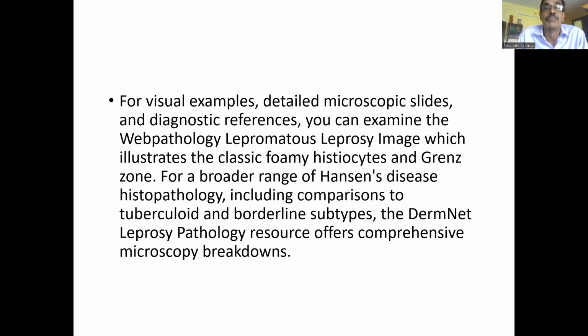For visual examples, detailed microscopic slides, and diagnostic references, you can examine the WebPathology lepromatous leprosy image, which illustrates the classic foamy histiocytes and Grenz zone. For a broader range of Hansen's disease histopathology, including comparisons to tuberculoid and borderline subtypes, the DermNet leprosy pathology resource offers comprehensive microscopy breakdowns.